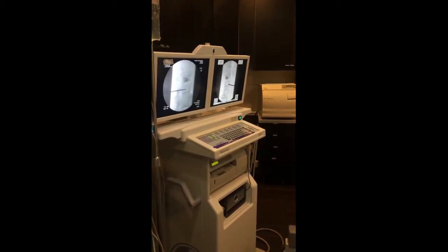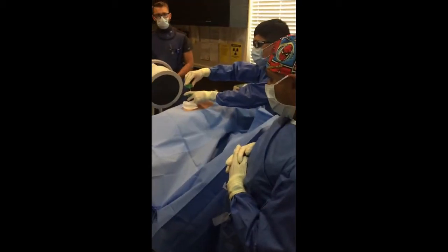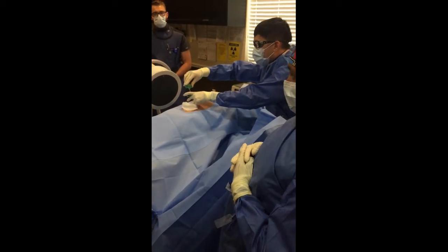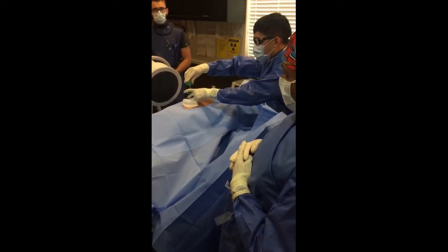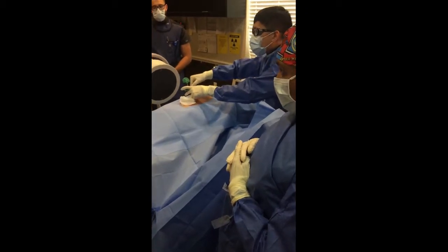Feeling pressure? Yeah. Okay, if it's too much, you tell me, sweetie. Is it too much? No, I'm okay. Okay, you're doing wonderful, okay? All right, go ahead, Dr. Chen, give it another half a twist of the drill. Good job. Okay, you're doing excellent.